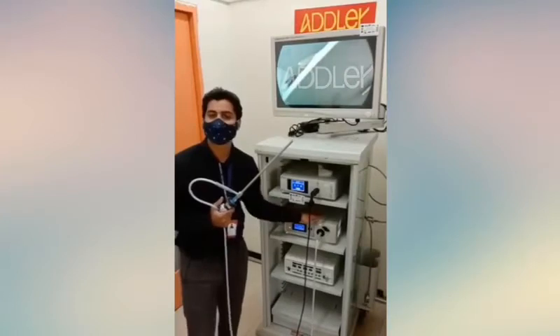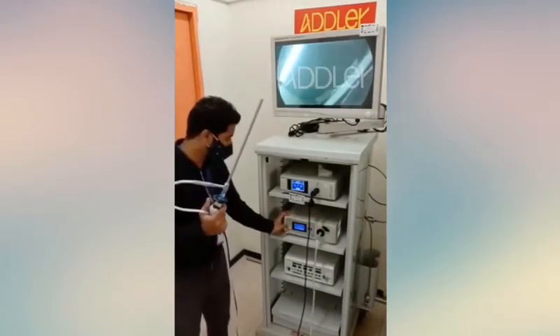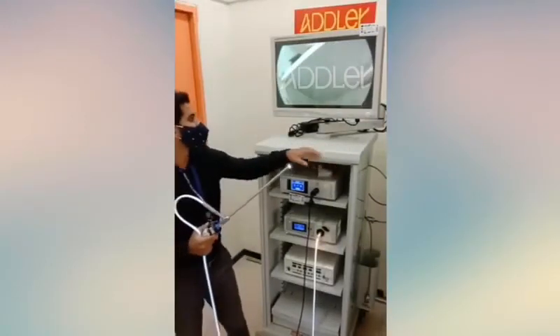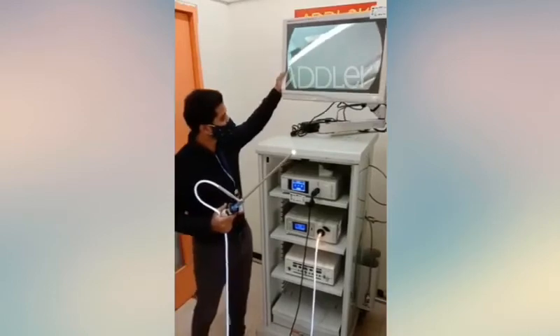The light source we're using here is the Xenon 8000, which is a very high intensity light source. Let's turn this scope on. We're using a Stryker FOC fiber optic cable. This trolley is also an original Stryker trolley, and this monitor here can be adjusted as per requirement.